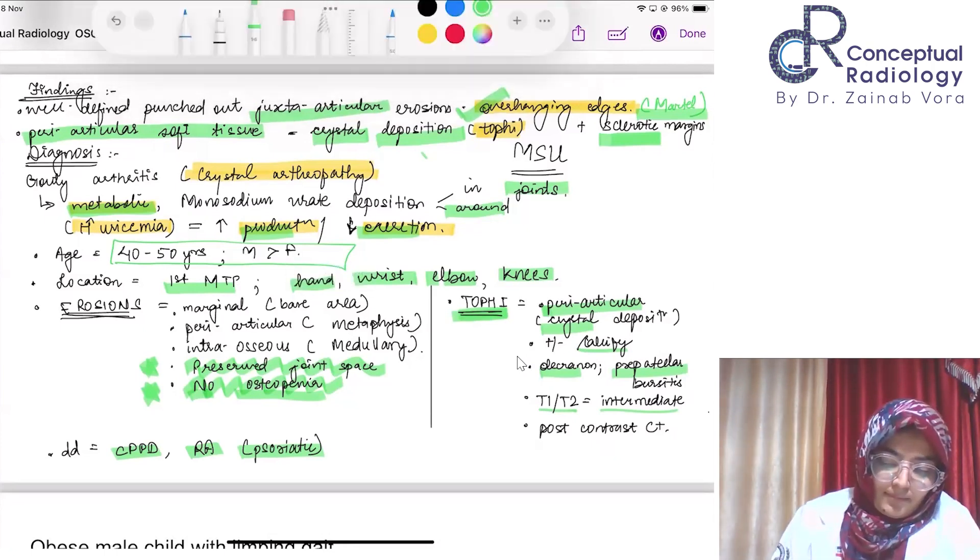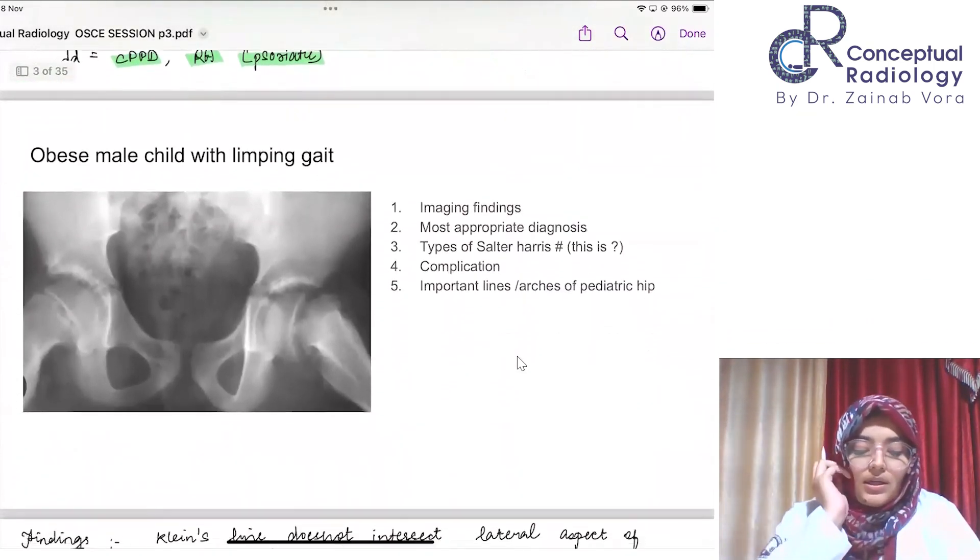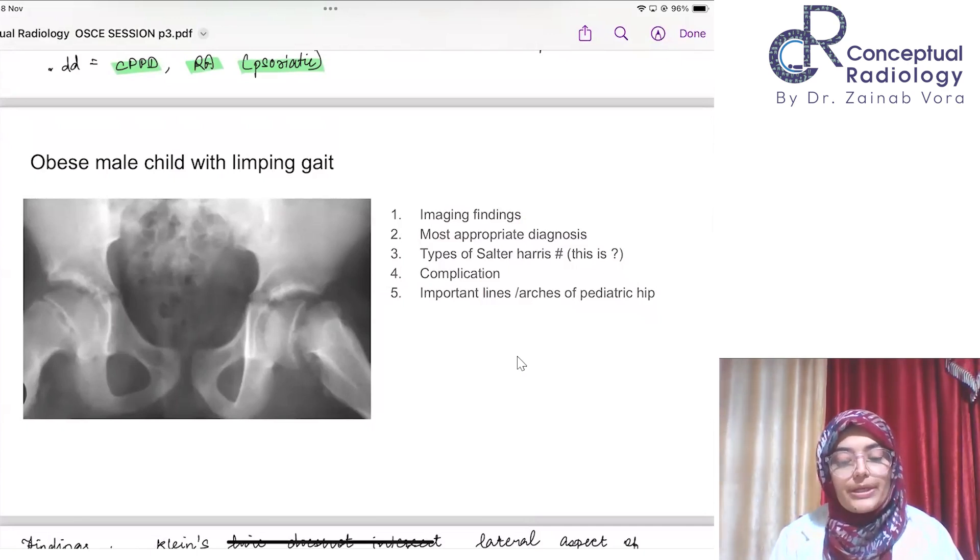This is an obese male child. I'll help you a little bit with the age of the child—it's not a very young child, he's like 13-14 years age group, a teenager. An obese teenage boy who is having limping gait. First, your findings, most appropriate diagnosis. You have to tell me about the types of Salter-Harris fractures and if this diagnosis falls into any type of Salter-Harris. Important complications of this disease process and important lines, angles, and arches in pediatric hip. Take your time, you have one minute.